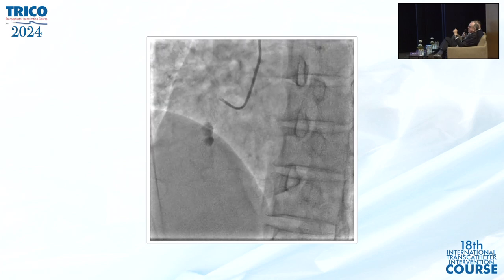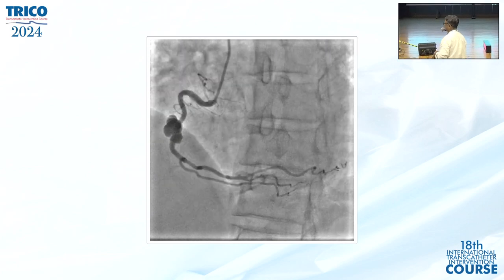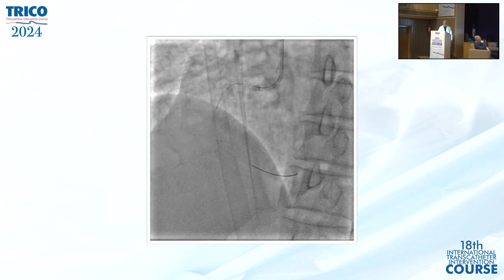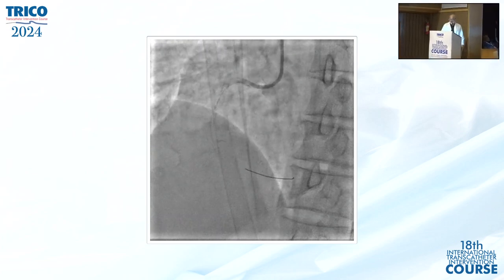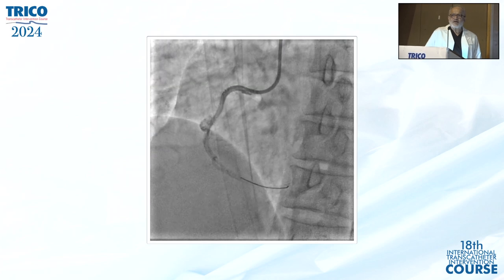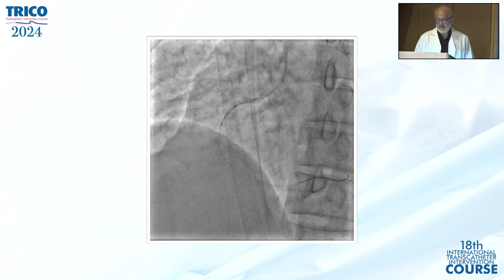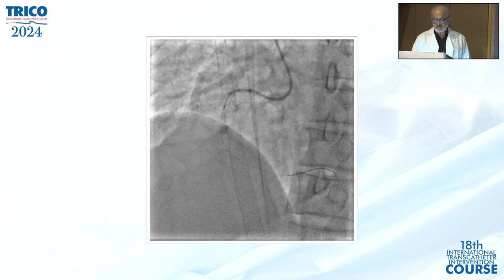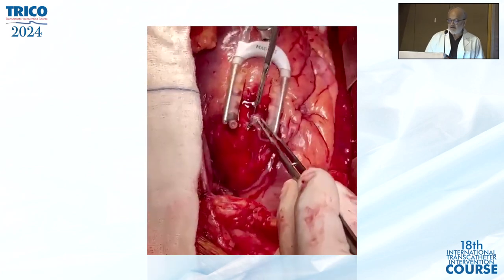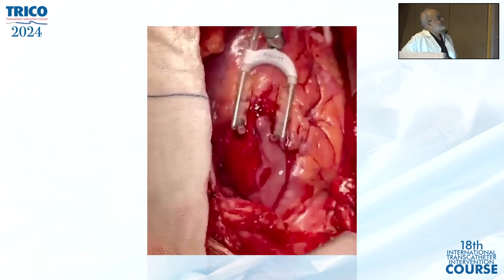You are very near, Malcolm. Yeah. In India, a lot of reuse of material has been there. Maybe infection. Yeah, infection. Good. So nothing was going in. I tried everything. Guide catheter. In fact, we damaged the patient. And then I think a lot of pain and other things. We got frustrated. We struggled for 1.5 hours, and then told our surgeon to take the patient on table. Everything tried. Nothing works. In fact, the flow was worsening. And the surgeon gave a cut there and it was full of pus. You can see it's a gush of pus.